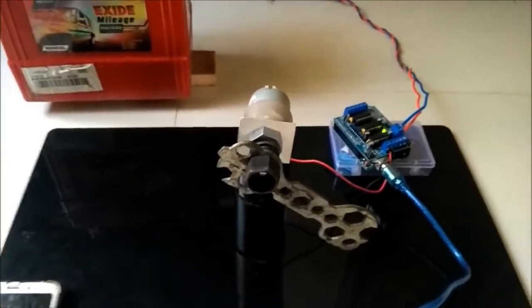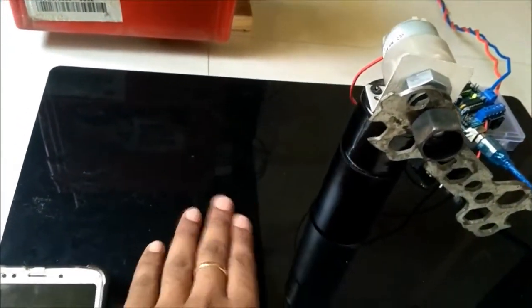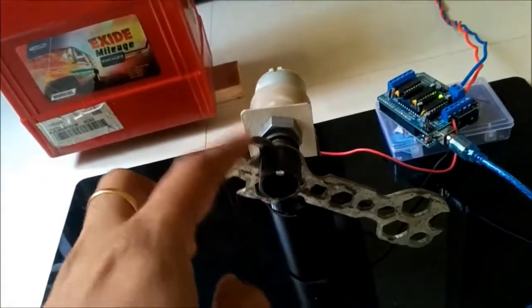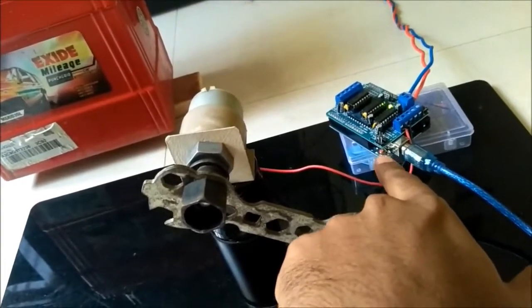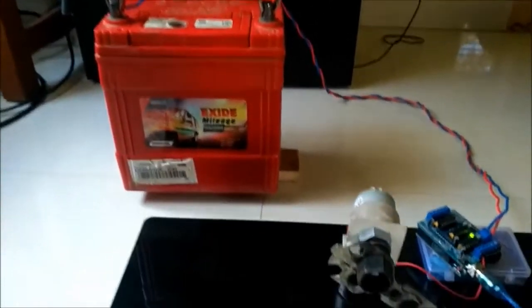Here is the setup. You can see a DC motor which is fixed to a frame, followed by this setup here. It's a horizontal board and a vertical shaft. The shaft has been connected to an arm through some kind of fittings here. The motor is powered by this Arduino microprocessor, which is programmed, and the voltage required by this motor has been scaled up using this motor shield, which is powered by a DC battery of 12 volts.